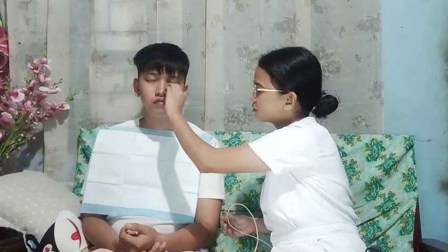Then I will now cleanse and dry the bridge of the nose and then apply skin protection. Assuming that I'm cleaning my client's nose to prevent any infection or any discomfort while inserting the tube.